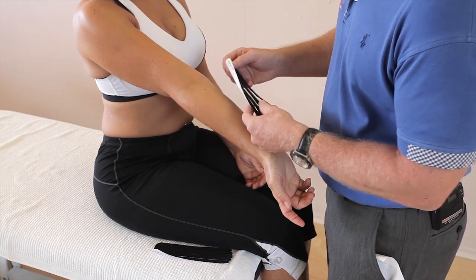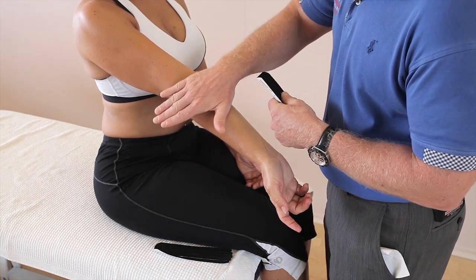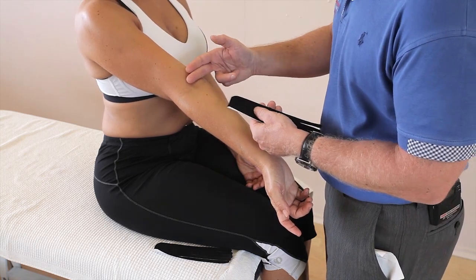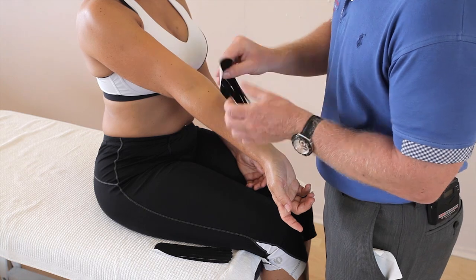One of the tapes is going to go from the inside out and then one's going to go from the outside in. These pads are going to go towards the lymph nodes — the cubital lymph nodes — so these pads tend to go towards that area.